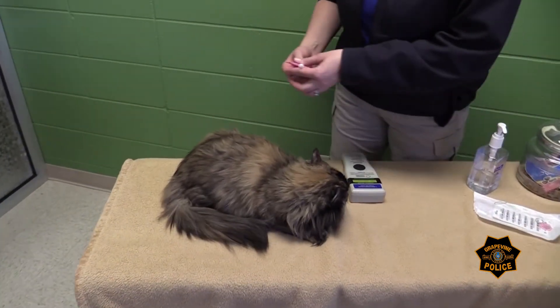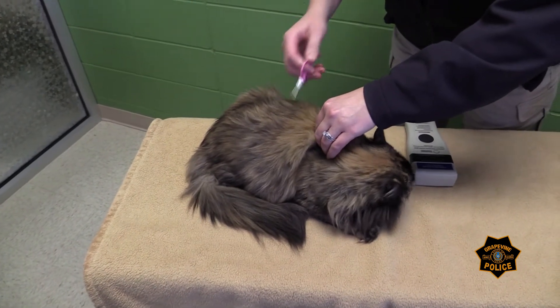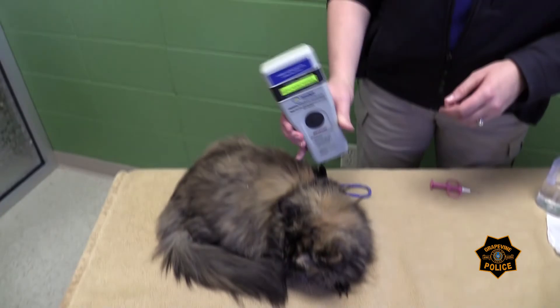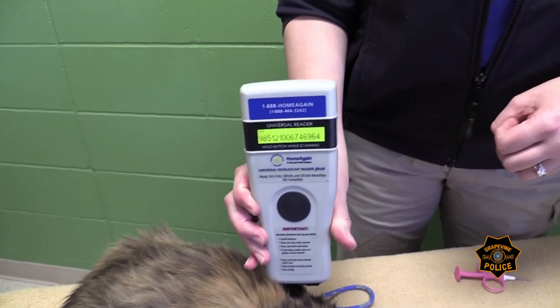Now time for a quick poke. Now I scan it again to ensure correct placement of the microchip. And that's all there is to it!